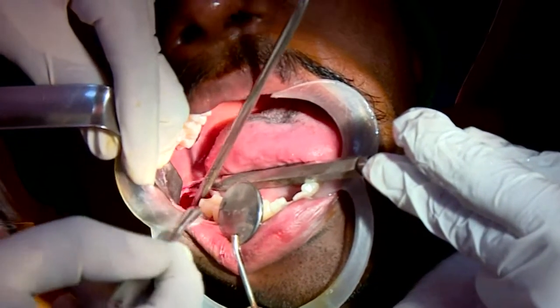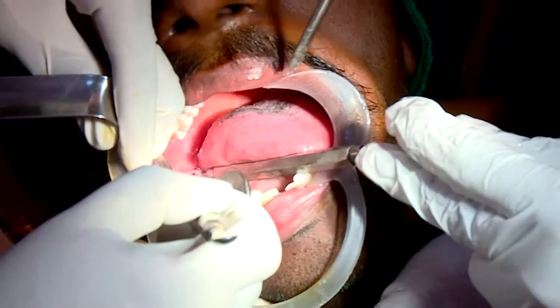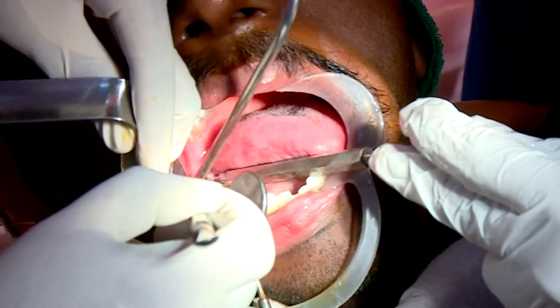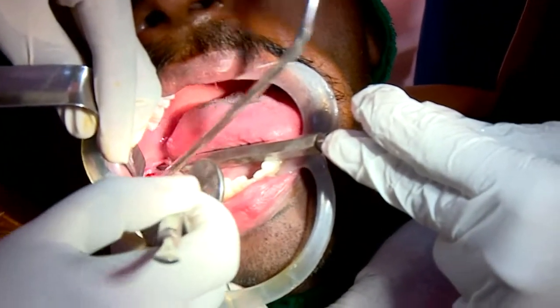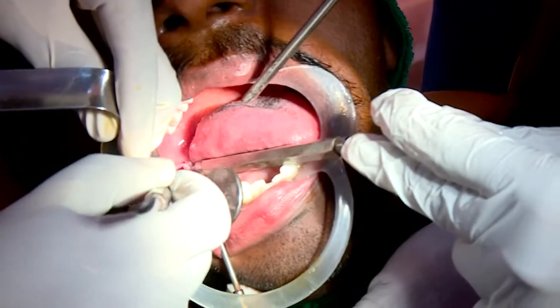Once the tooth is removed, the entire socket is inspected for any risk of hemorrhage, any injury to the inferior alveolar canal, any perforation on the lingual side, or any injury to the inferior alveolar nerve. No such evidence is there; the entire socket is clean.